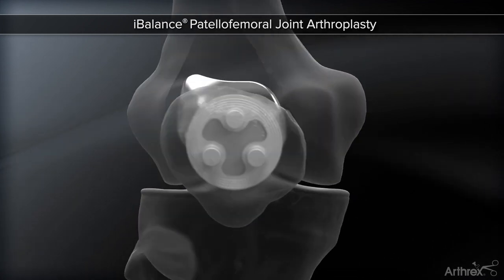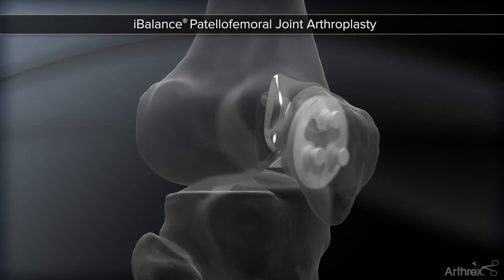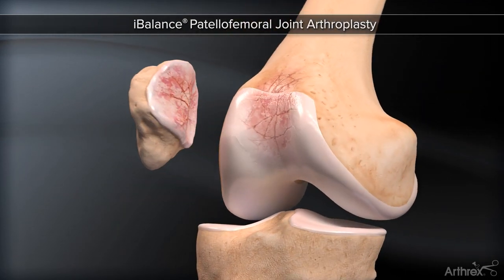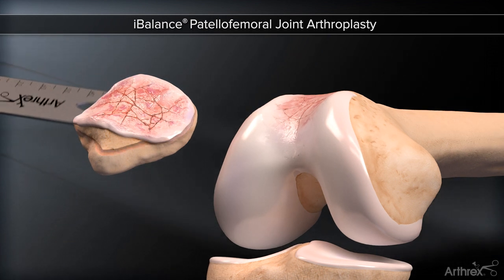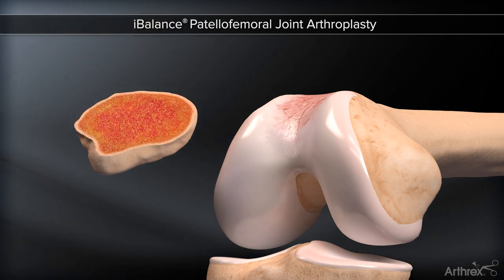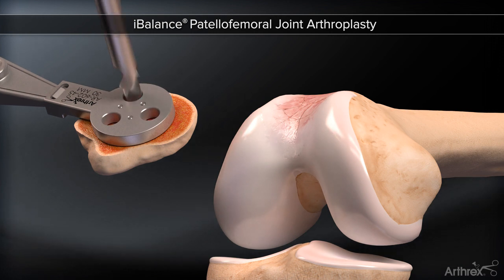Patellar preparation may occur prior to or after femoral preparation, depending on surgical preference. A caliper is available to measure the thickness prior to and after resection. The size of the patellar component is assessed and lug holes are drilled to accommodate pegs on the domed patellar component.